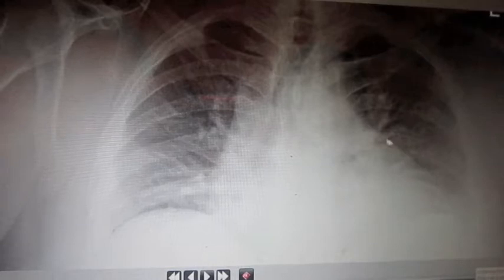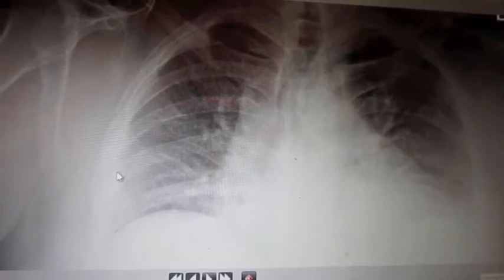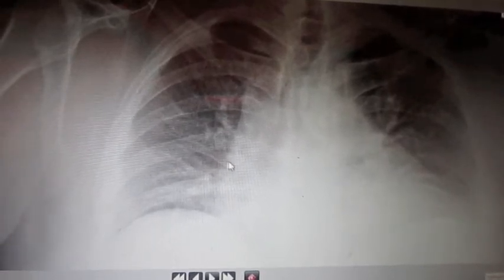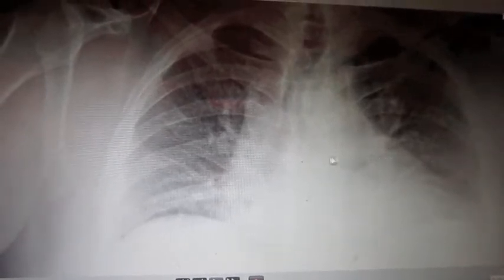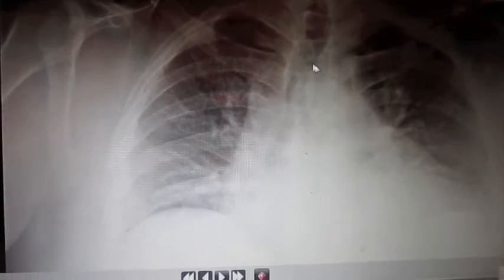The heart border is very, very clear on this side, and on this side also you can see the heart border. The border is nice and clear. You can see the ratio of the chest cavity to the size of the heart — that's normal. So the heart is normal. You can also see the pulmonary vasculature, which is also normal.